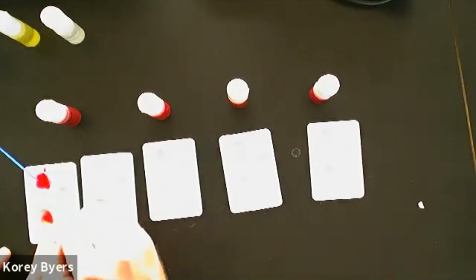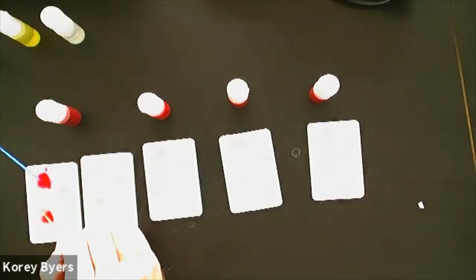Do you see those tiny red dots that are forming? That's clotting, or agglutinating is the word, agglutination. And so for B, we'd have to say yes, because it looks like June has type B blood.